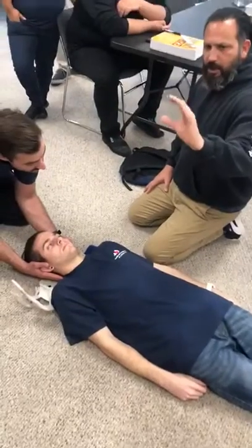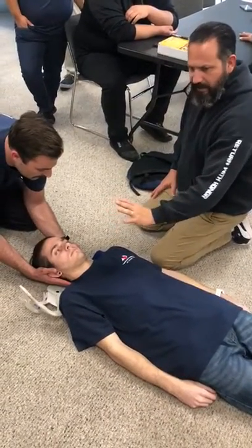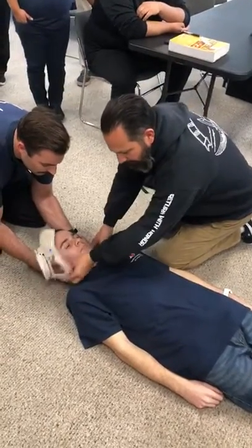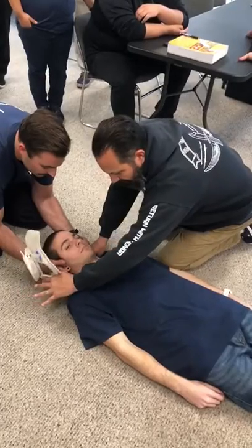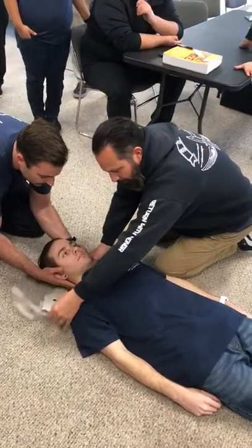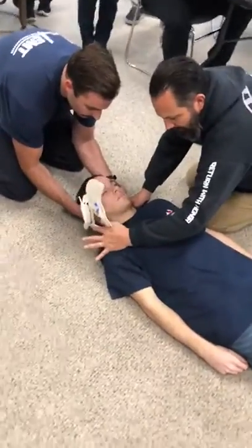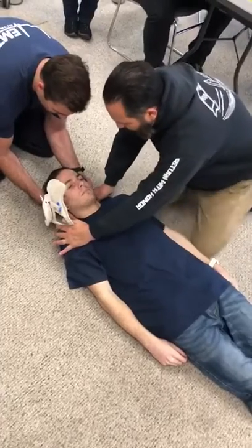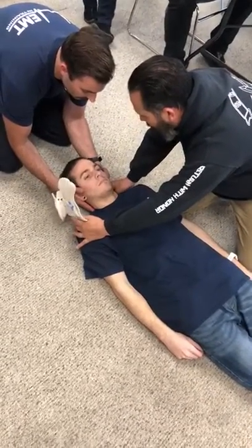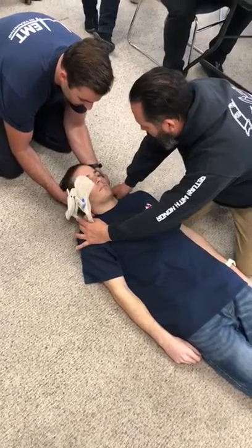I'm in charge of everything here. This portion right here — I'm always managing this part. By holding it up here you'll see how much easier it makes things, as opposed to keeping it above the shoulder. Managing it is going to make the difference. I'm working with my partner — he still has the head lifted. Am I centered? A little more to my left — right there.